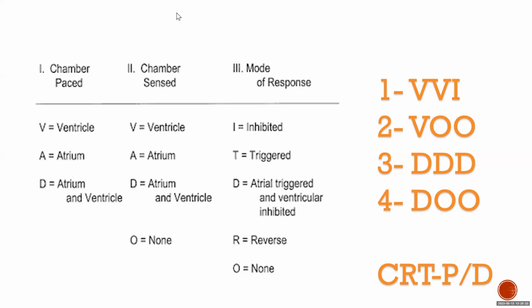Can I ask what's the meaning of sensing? The difference between pacing and sensing. Yeah. So sensing is what the lead is seeing. We'll come back to that in a second, but I'll just briefly discuss it now. Sensing is what the lead is seeing in terms of activity, or even external activity like electrocautery. Pacing is the electrical output from the device to capture the myocardium.